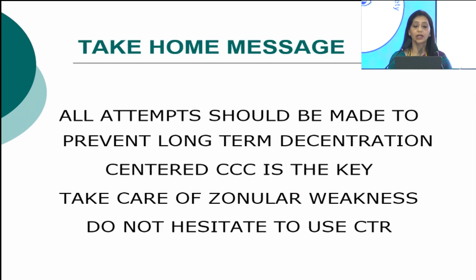The take-home message is, all attempts should be made to prevent long-term decentration. A centered rhexis is the key. Take care of zonular weakness and do not hesitate to use the CTR.